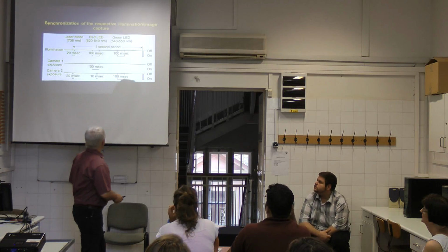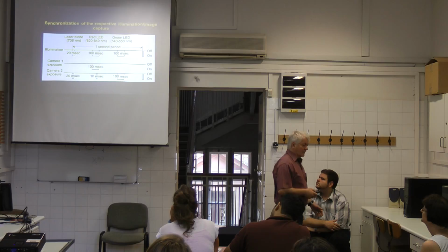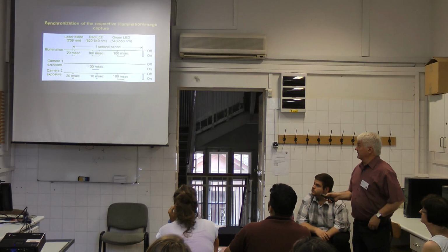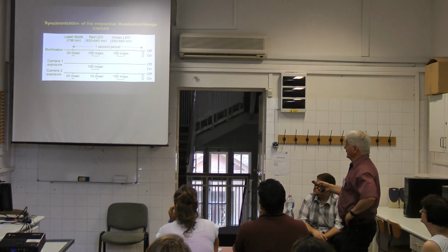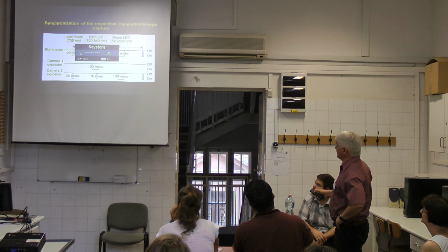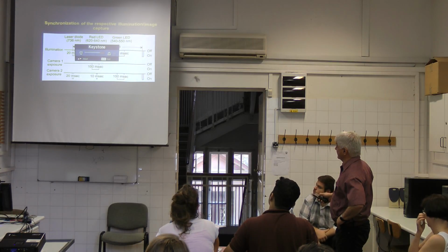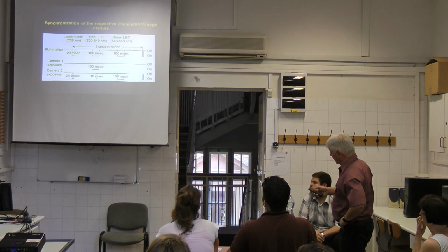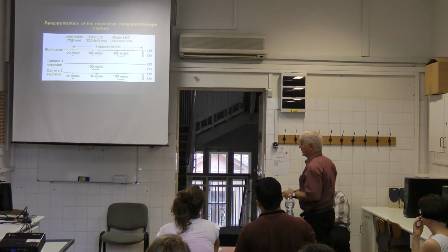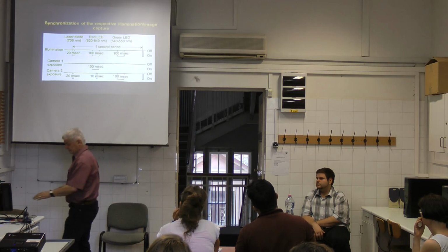So this is the time sequence, how we make a measurement. We illuminate sequentially the brain with laser diode, with LEDs, and we use two cameras taking pictures and simultaneously collect these images and process them.